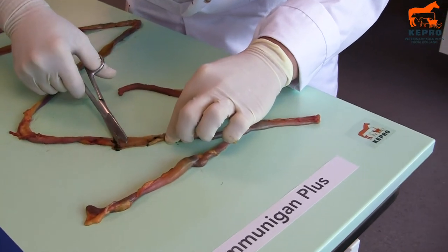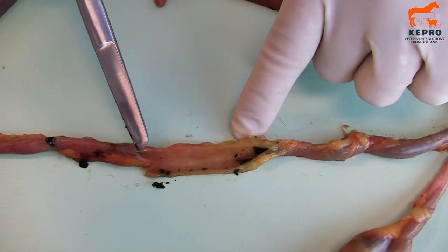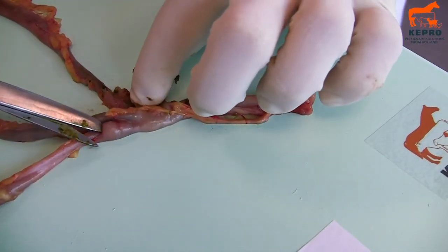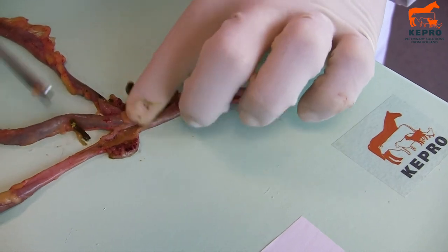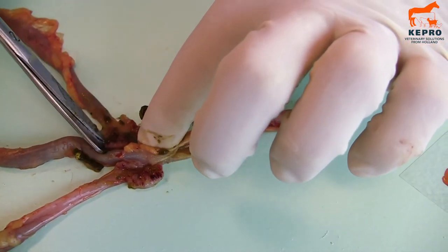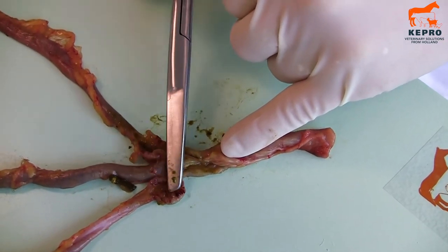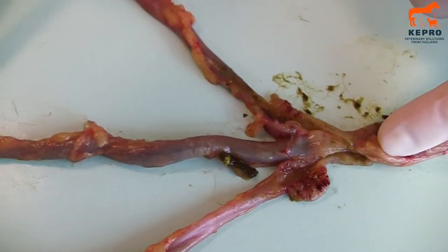Here is some food that is left there, but you can see the gut wall is completely intact — no redness, no bleedings, and of normal size. Then we look at the lymph nodes of the gut walls, which are exactly here. And this one, in contrast to the other bird, is activated. So this can mean that it has just been vaccinated, or there can be a viral infection present in the chickens. This is the place where you always have to look in the gut to see whether it's red and swollen. This one is indeed a little bit activated, so that is in very big contrast to the very good gut health the chicken otherwise has.